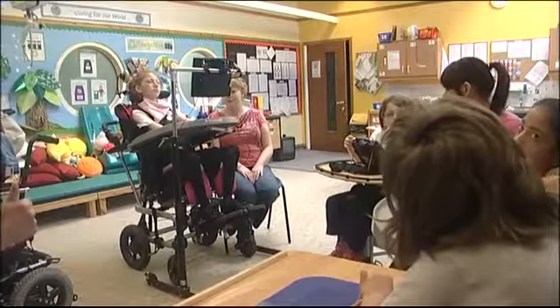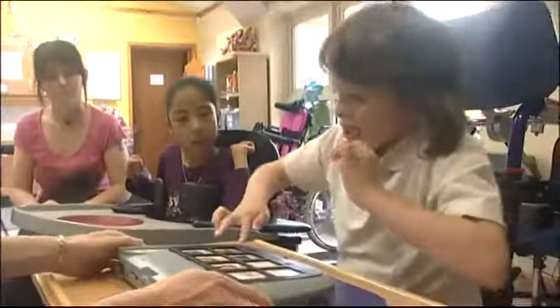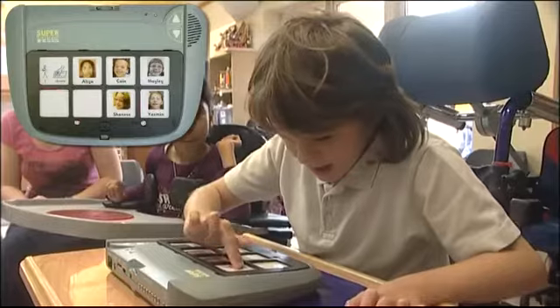Everybody. And now it's time for us all to say hello. The children are of varying ages, and they're in that class to practice using their communication aids so they're able to communicate effectively when they move up into a more mixed class environment in Key Stage 3.